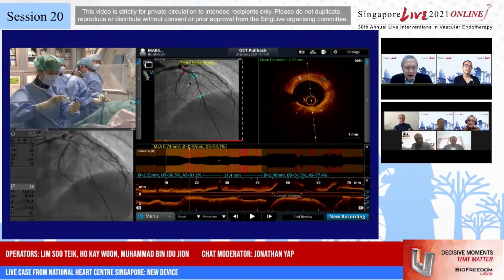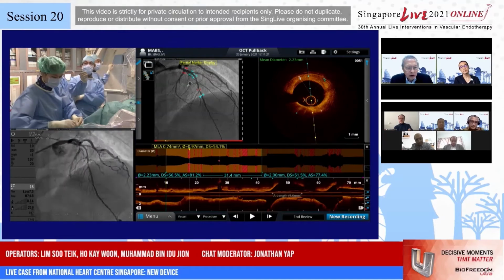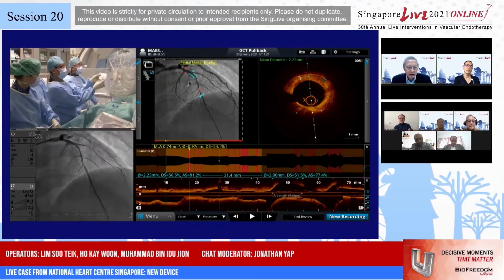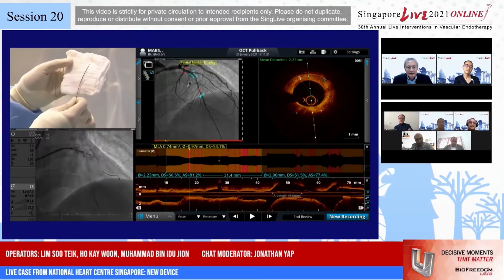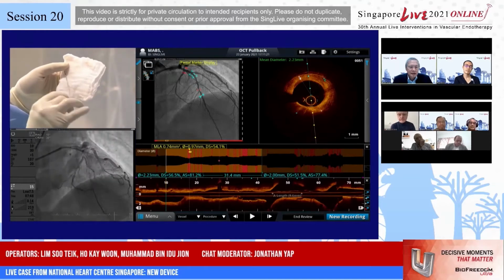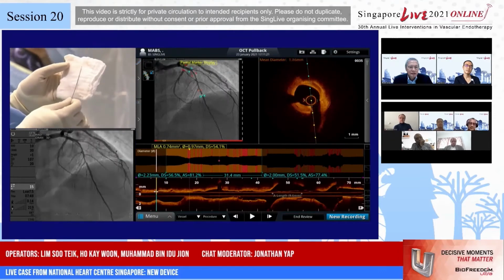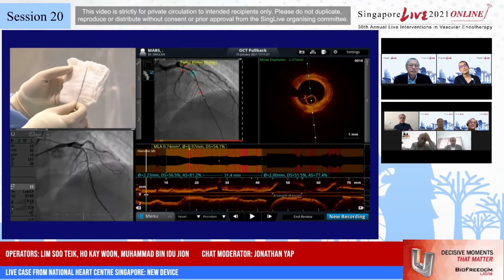Do you think there is a myocardial bridge segment at the distal stenosis or not? Further distally, everybody can see the stents against the gauze. I think it looks like any normal stents. Even intravascularly, we can't tell the myocardial bridging from the OCT very well.